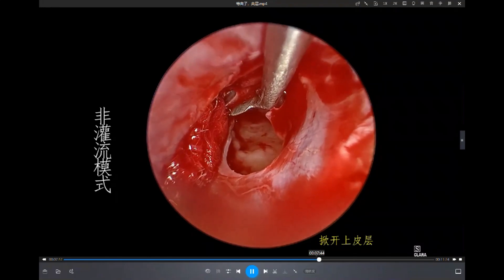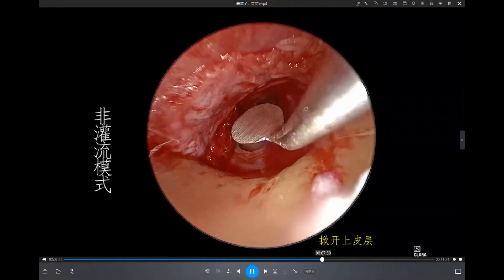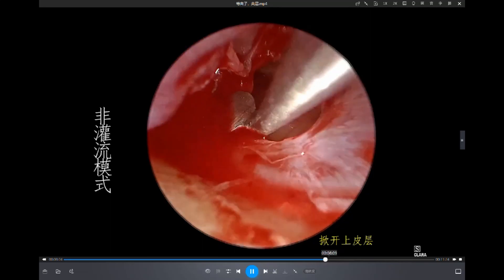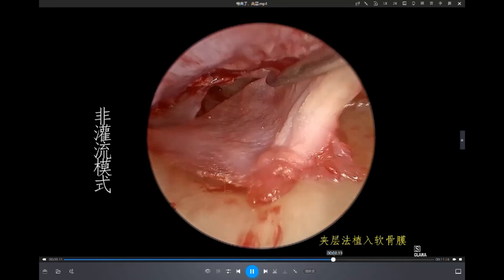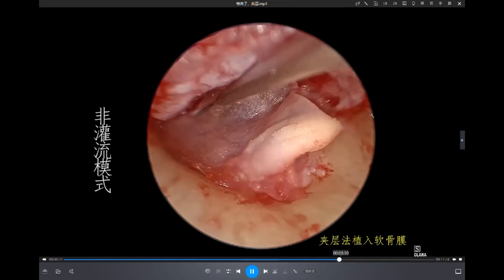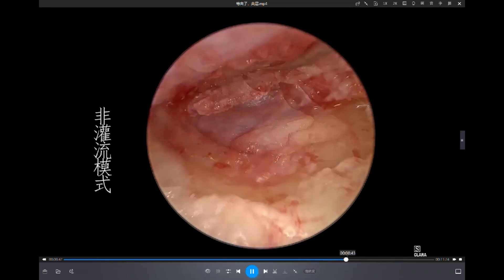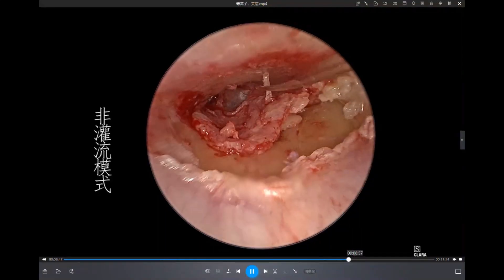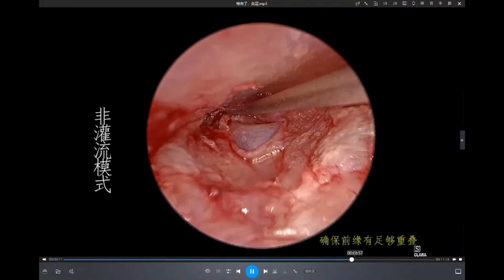Then we harvest some membrane or cartilage and put the membrane into that space. Then we replace the residual tympanic membrane and flap.